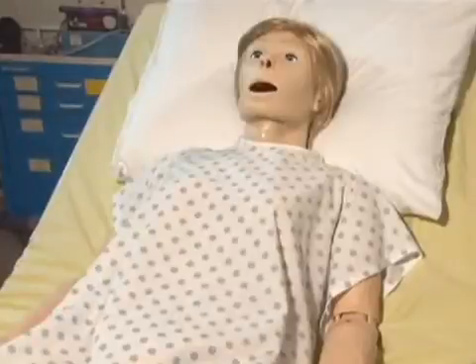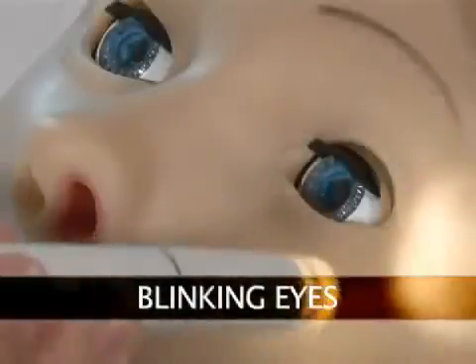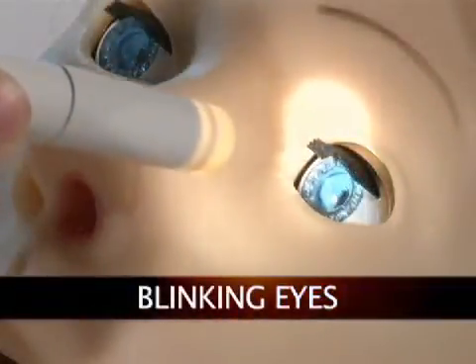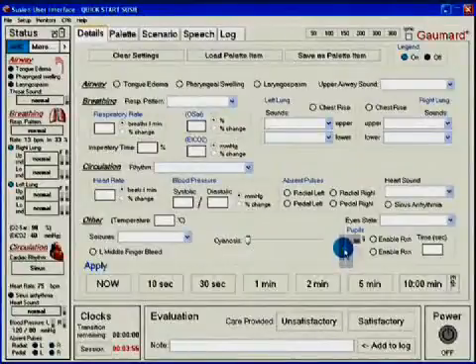Now that your Susie Total Mobile Solution Simulator is ready for use, let us take a tour of her many features. State of the art total control blinking eyes with photosensitive pupils. The dilation state of the pupils, the blinking rate and light reactivity are easily manipulated from the tablet PC, giving the user total control.